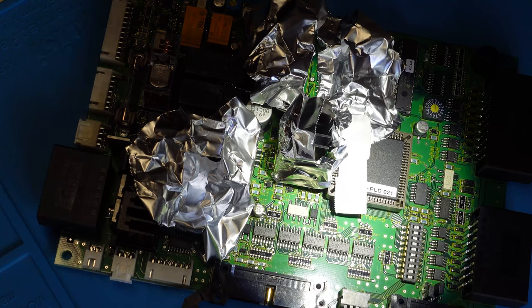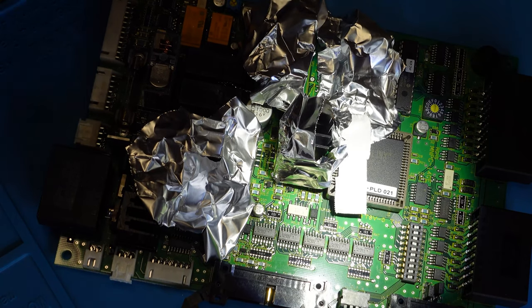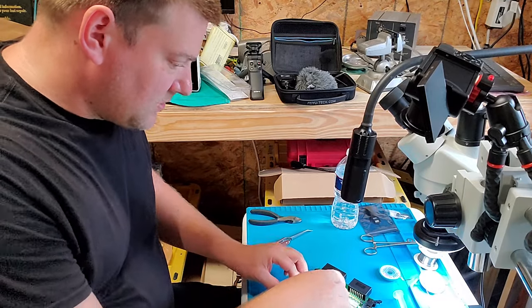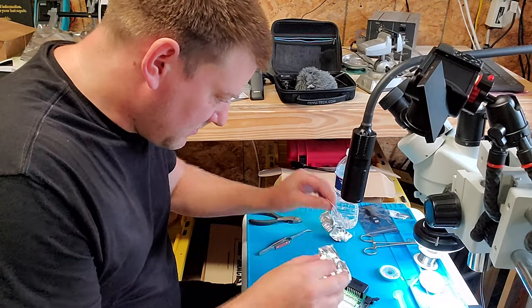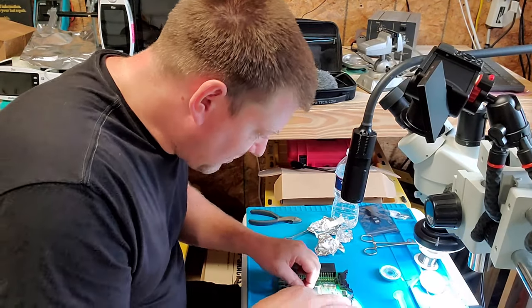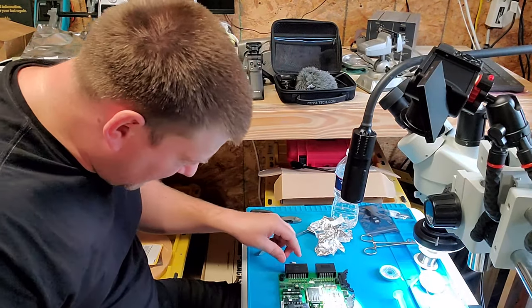There we go. Too easy. That guy came up nice and smooth. All right. So now we can remove our masking. Make sure we get it all. Last thing we're gonna do is leave some aluminum foil floating around in here.